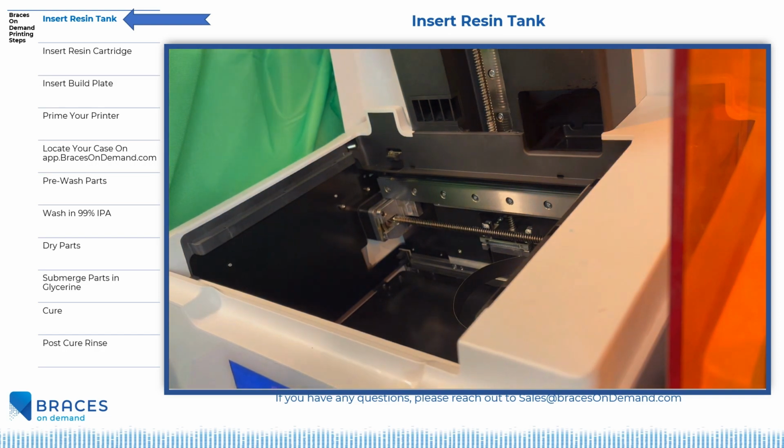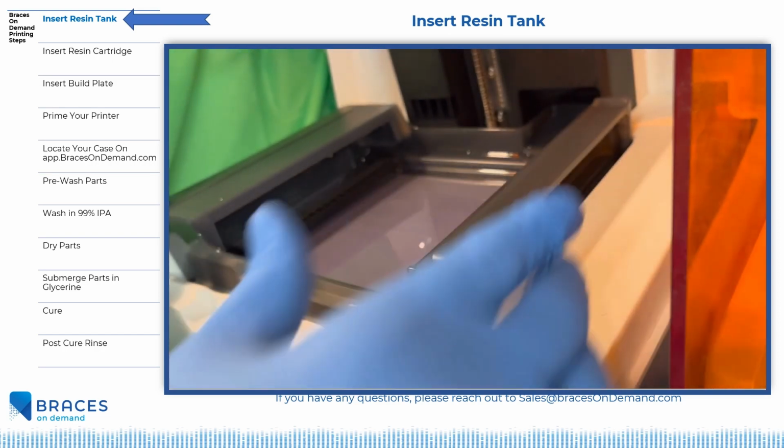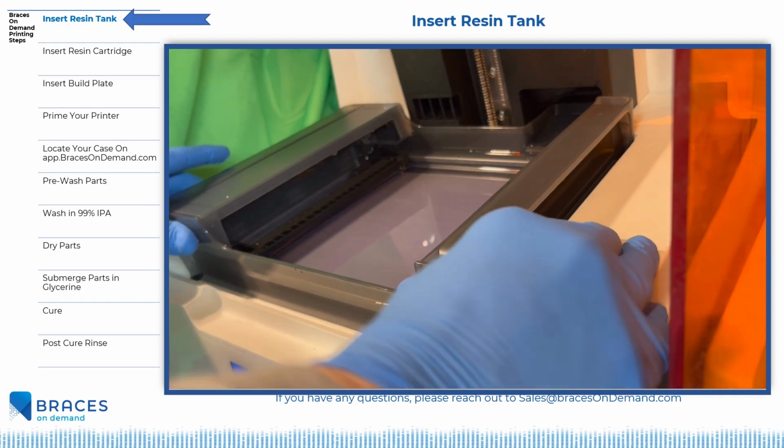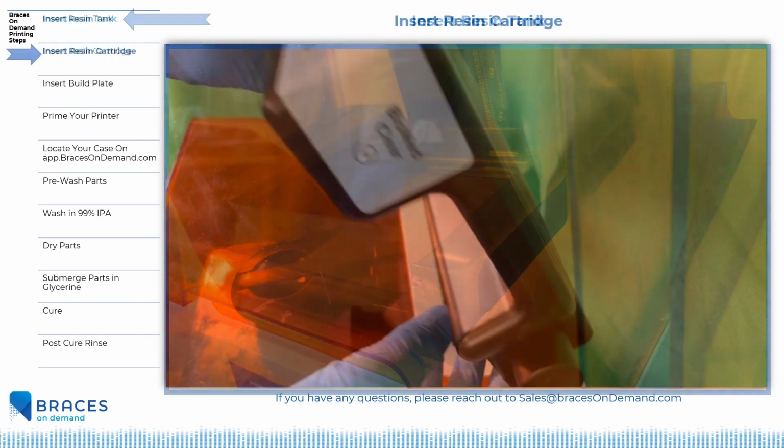Let's get started. While holding your resin tank with two hands, rest the tank in your Form 3. Using two thumbs, gently push towards the back of the printer to seat your tank. Your Form 3B will chime letting you know when the tank has been properly seated.